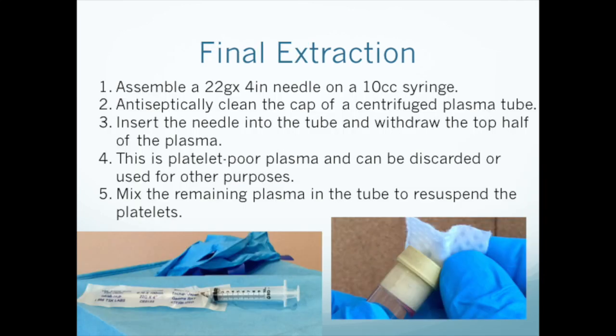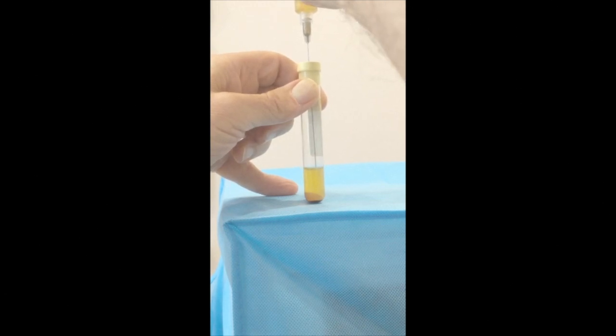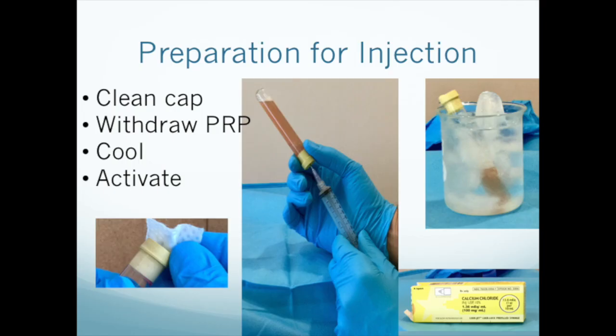At this point, you will gently remove each tube from the centrifuge. Assemble one of the 4-inch needles on a 10 cc syringe. Antiseptically clean the cap of the tube, insert the needle, and withdraw the top half of the plasma. Then mix the ACDA tube to re-suspend the platelet pellet — we use a vortex mixer, but any adequate mixing is fine. You now have a high-concentration PRP ready for injection. You can withdraw it from the tube and inject it immediately, cool it and then withdraw and inject it, activate it and then inject it, or just save it for later injection.